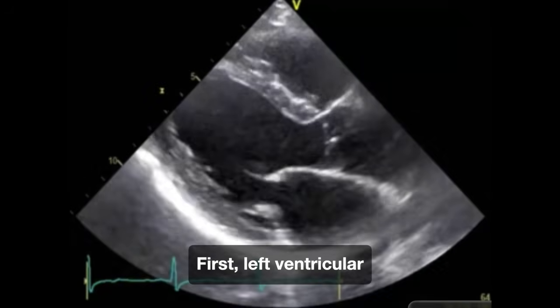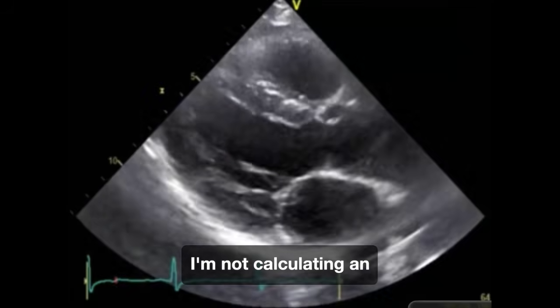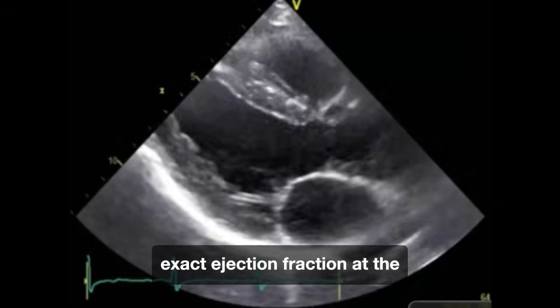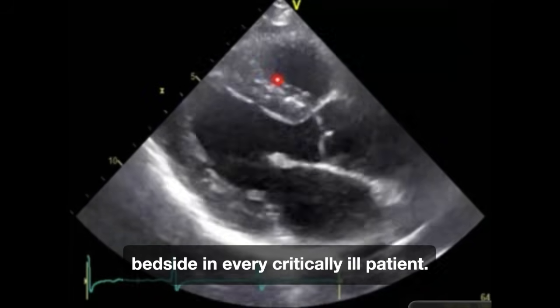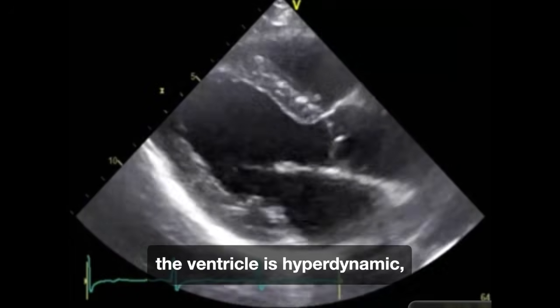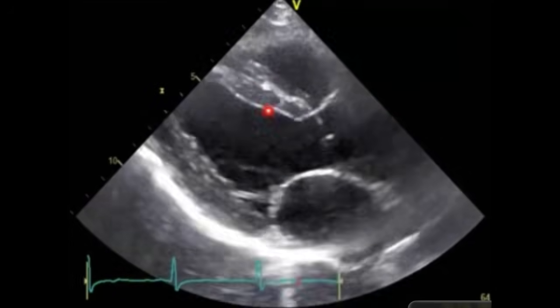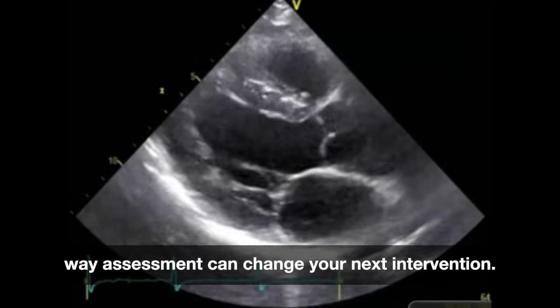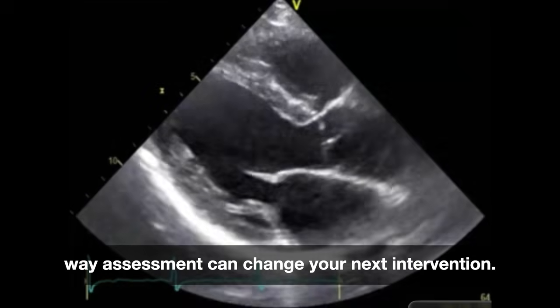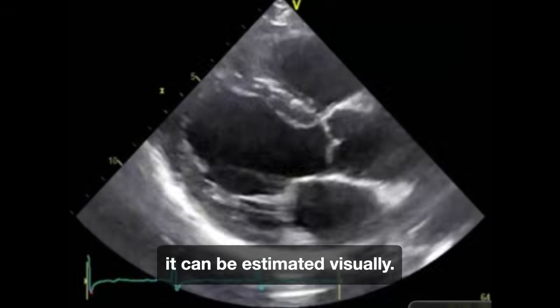First, left ventricular size and gross systolic function. I'm not calculating an exact ejection fraction at the bedside in every critically ill patient. I initially want to know whether the ventricle is hyperdynamic, normal, or poorly contracting. In the ICU, this 3-way assessment can change your next intervention. With sufficient experience, it can be estimated visually.